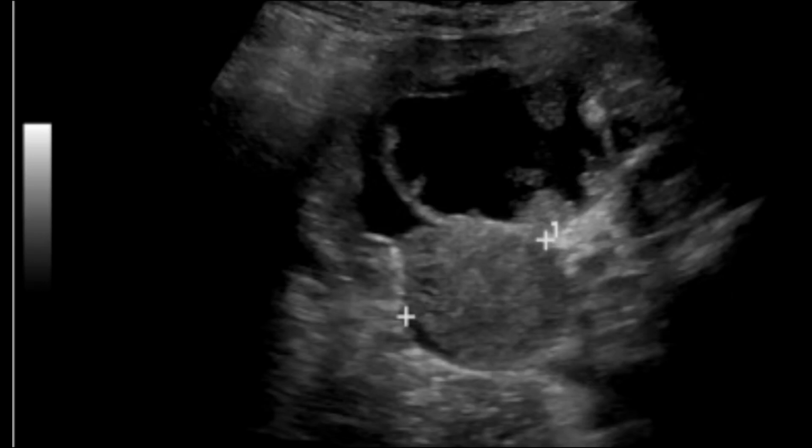This is a predominantly solid spherical mass with slightly heterogeneous echotexture. However, internally no central necrosis, no hemorrhage, and no cystic formations can be seen.